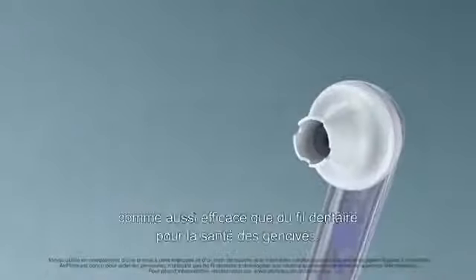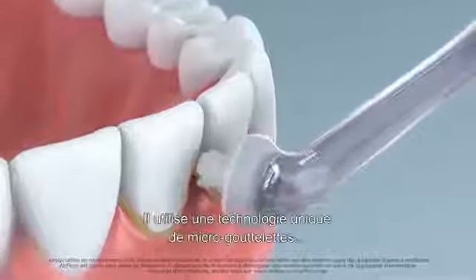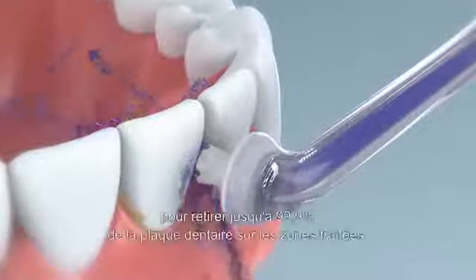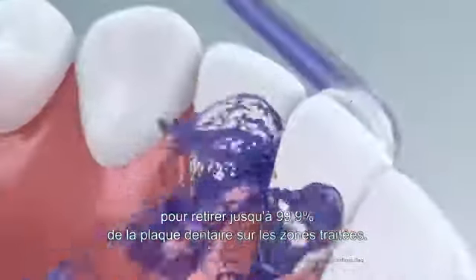The Philips Sonicare AirFloss Ultra is clinically proven as effective as floss for gum health. It uses the unique microburst technology for up to 99.9% plaque removal from treated areas.